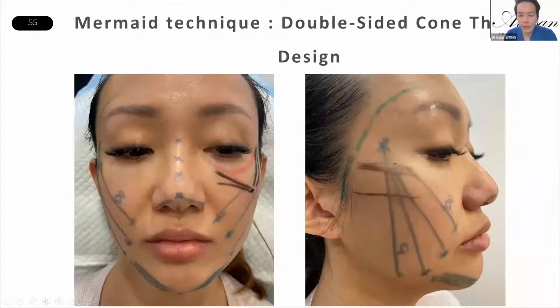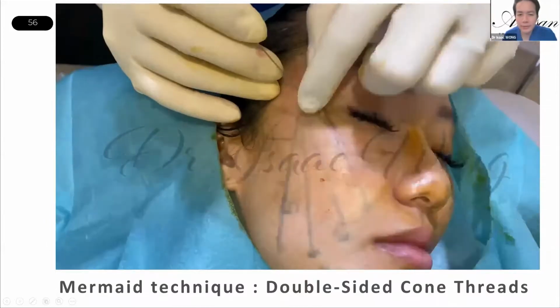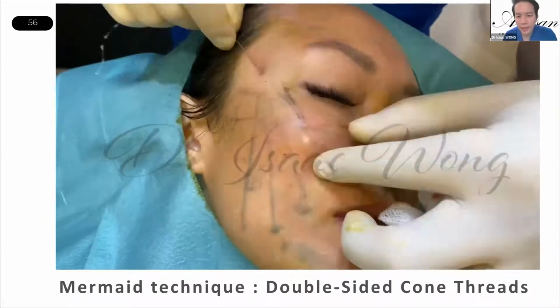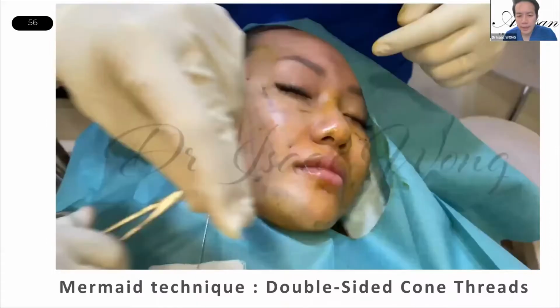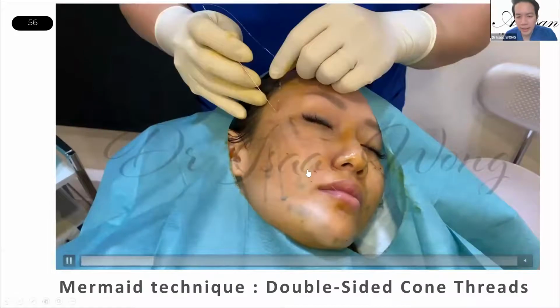For PLA cones, same thing: one entry point, and then two arms of one thread into the nasolabial area, and then two into the jowl area. Let's take a look at the video demonstration. Same thing, go deep first, then go superficial, and then hook it at the end and come out. Okay, cut and then drape the tissue over the cones. You can see an immediate tightening effect here.